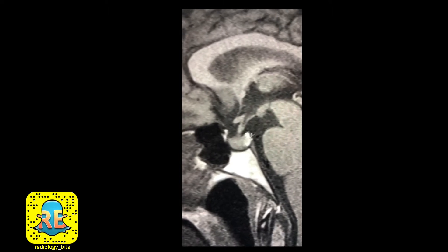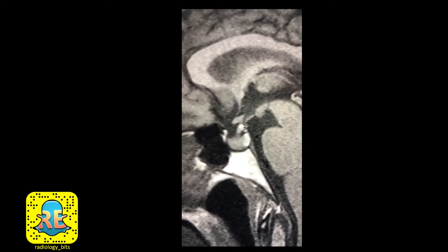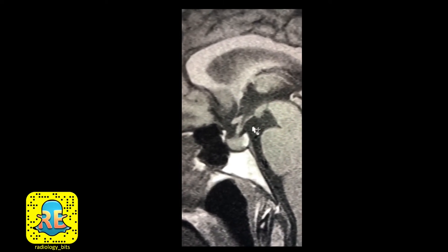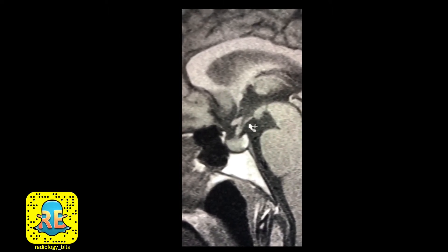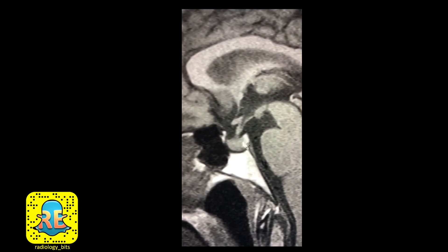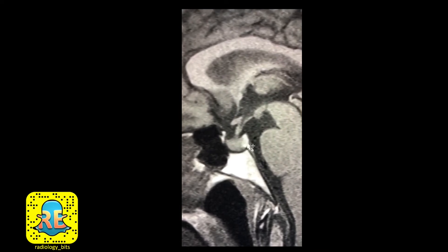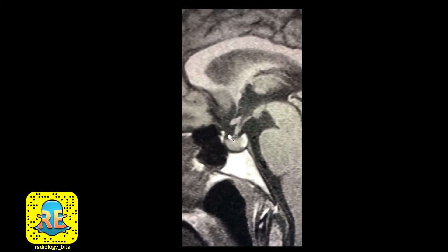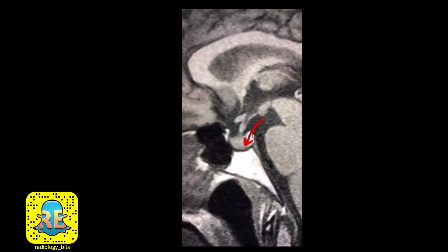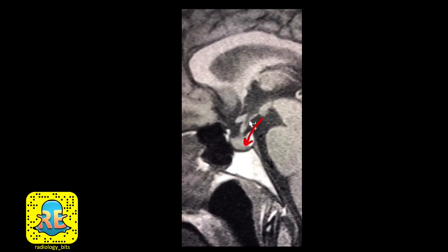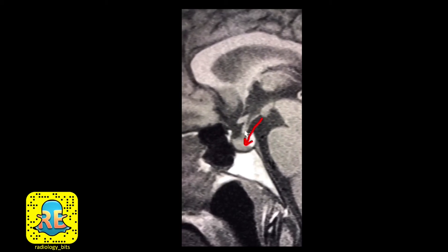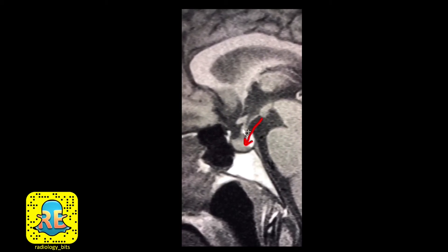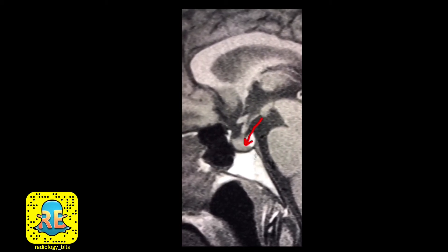That's why this part of the CSF space is called the suprasellar cistern — it's above the sella turcica and the pituitary gland. As noted, the hypothalamus is connected through the pituitary stalk to the pituitary gland.